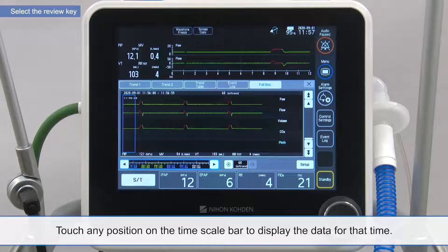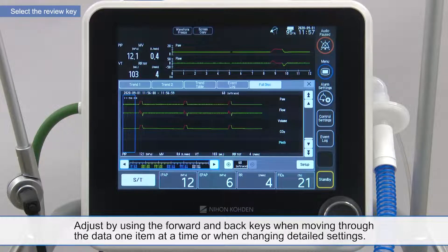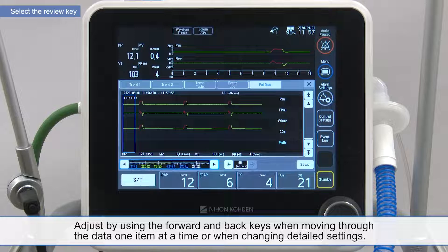Touch any position on the time scale bar to display the data for that time. Adjust by using the forward and back keys when moving through the data one item at a time or when changing detailed settings.